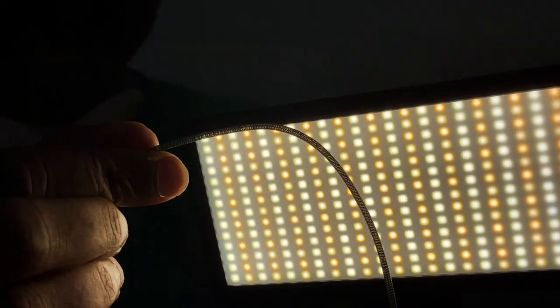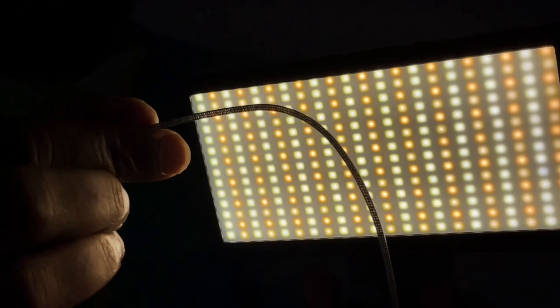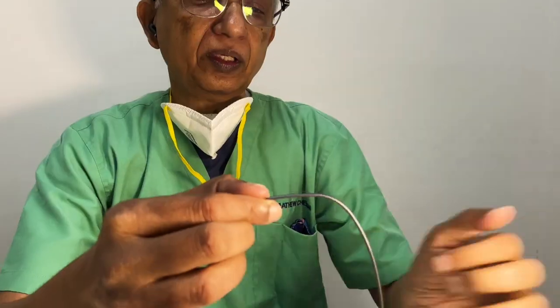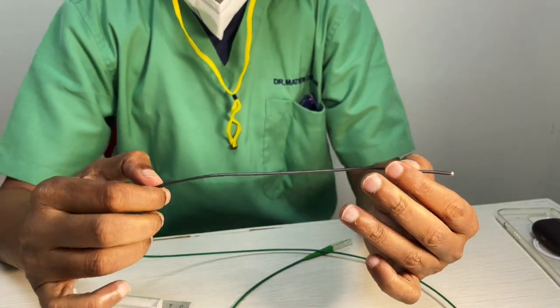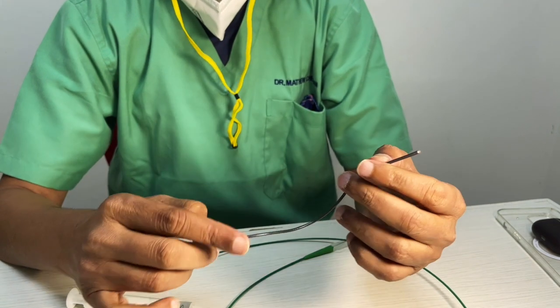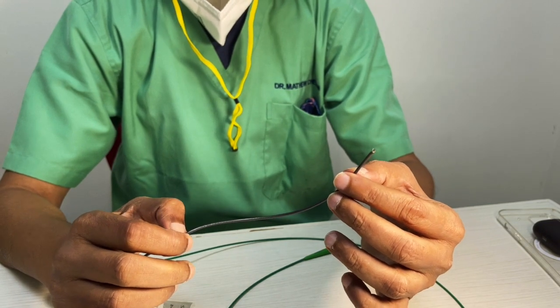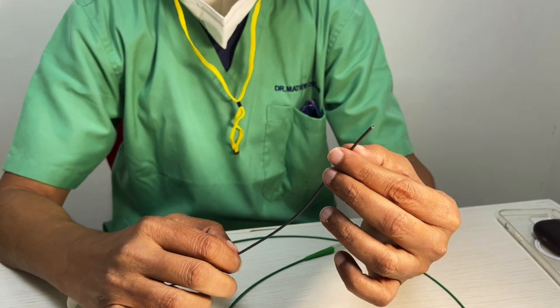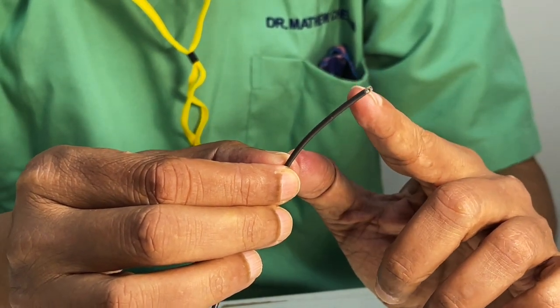You can see it looks like X's. Can you see that? Now, this is a compound braiding that they have done, when they used two forms of braiding. The first is a spiral braiding which they have done. You cannot see it properly in this. Along with the spiral braiding, they have also used a double X braiding. And the complete platform is nitinol. So the thing is, how do you get a profile when you do these braidings? I told you last time, it's actually not by round wires, but by flat ribbons. So you see right up to the distal end, they have run this right up to the tip.